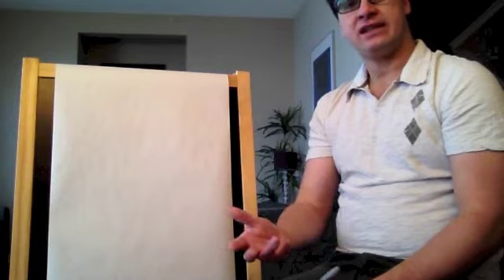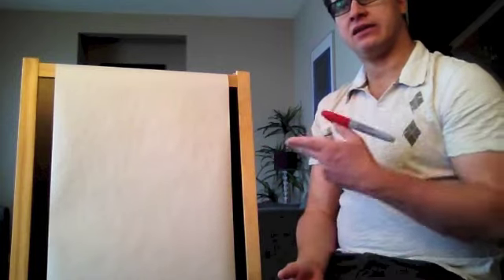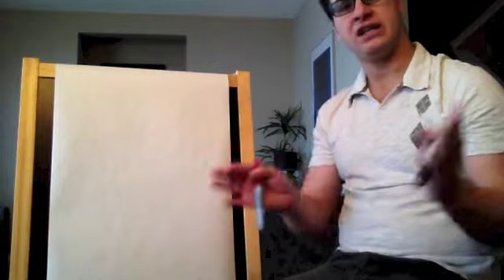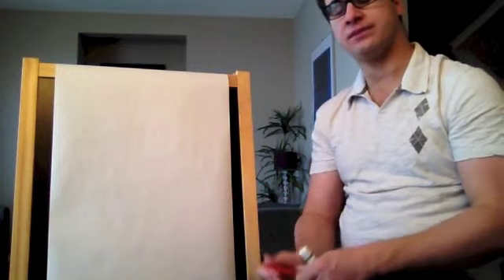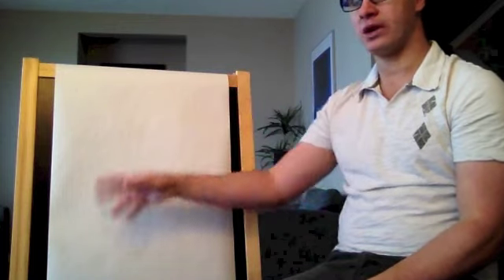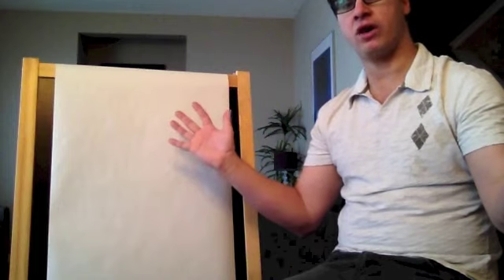The problem with this is that things can change between the moment that you took it and right now. If you took it 30 minutes ago or 45 minutes or 2 hours ago, things could have changed and you won't see it. On the monitor, you may see it, but you may not, because, as we're going to see, you're looking at a certain area of the heart, while the 12 lead looks a little bit broader.